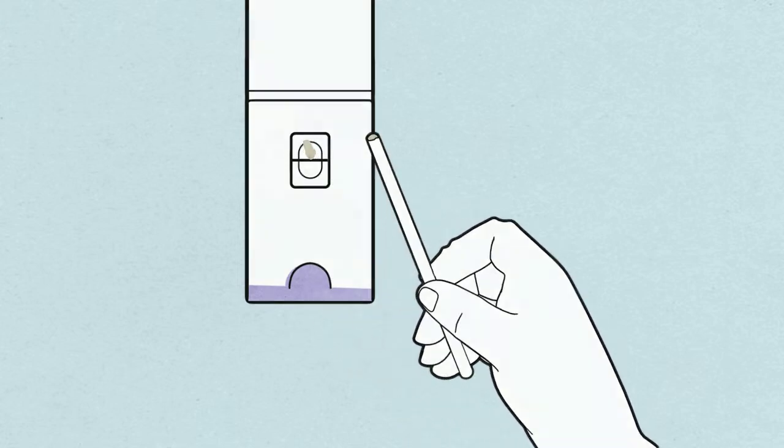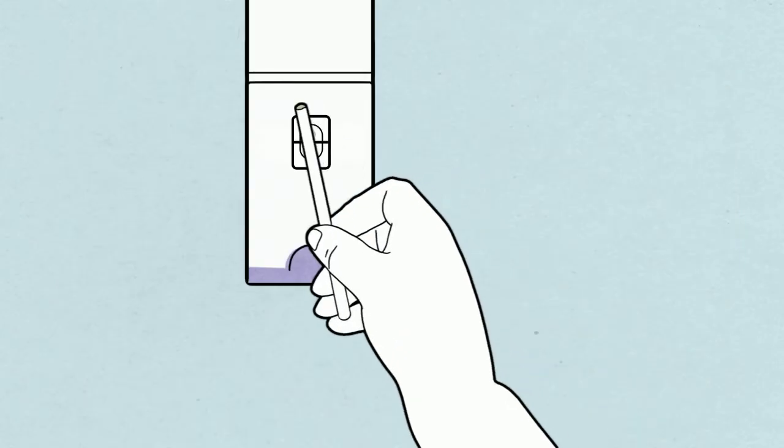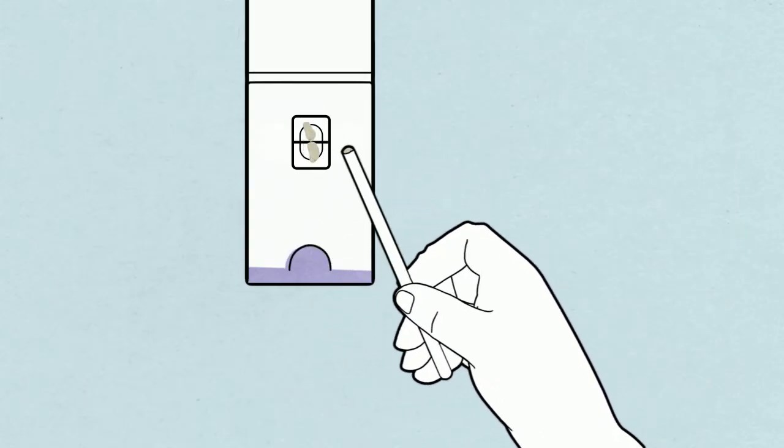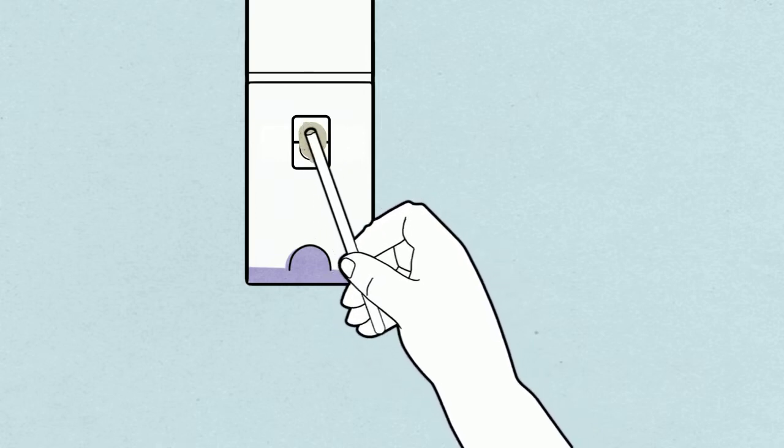Apply the sample to the top half of the window of your first card. Take a second sample from a different part of the stool and apply it to the bottom half of the sample window.